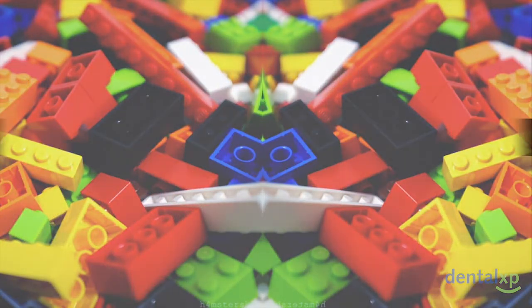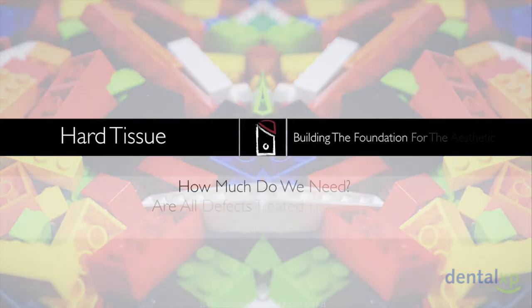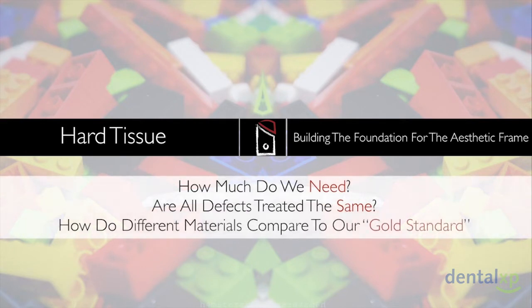So when we talk about augmentation procedures, the questions to be asked are: how much bone do we need, are all defects managed the same, and how do the different available materials and techniques compare to autogenous bone, which was once and may very well still be considered our gold standard for bone augmentation procedures.